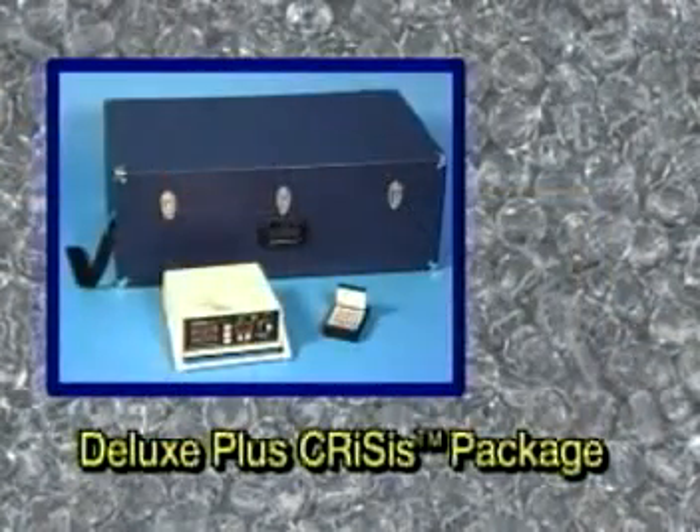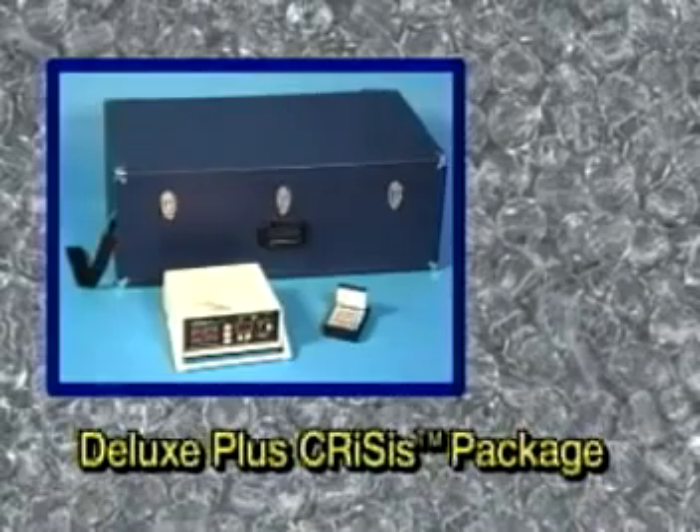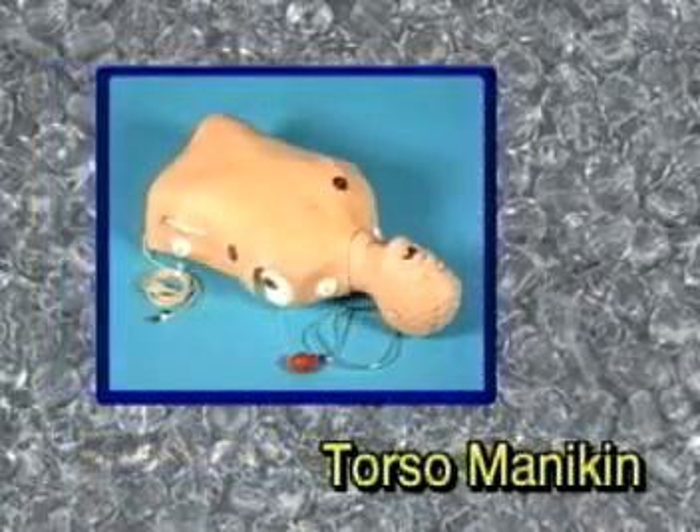In addition to the complete crisis mannequin, there are packages available with a patient simulator, printer for CPR evaluation, and a hard carrying case. There are also two torso mannequins available that provide the same quality, durability, and reliability as the full-size mannequins, only in smaller, easier to transport versions.